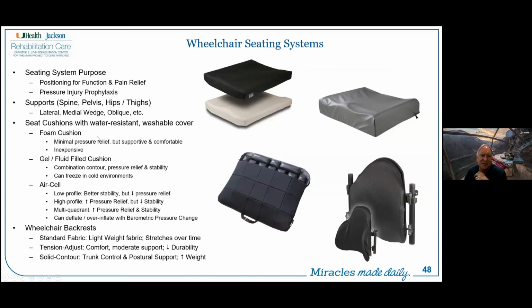There are a number of different seating cushions available. Foam cushions are generally not appropriate for our persons with spinal cord injury because they don't give enough pressure relief. Typically, we're going to use either the gel fluid-filled cushions, which provide contour and pressure relief as well as stability, but these can freeze in cold environments. Not a problem maybe here in Miami, but if folks are up north in the cold weather, it could be a factor. And then the air cell cushions.